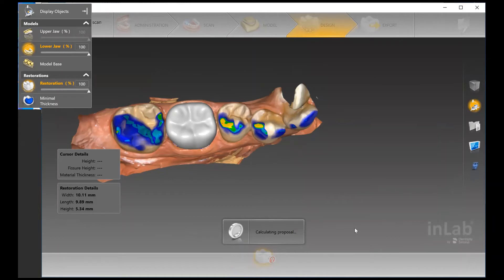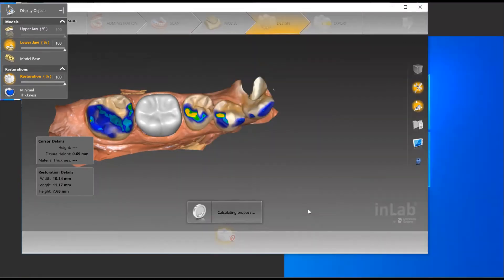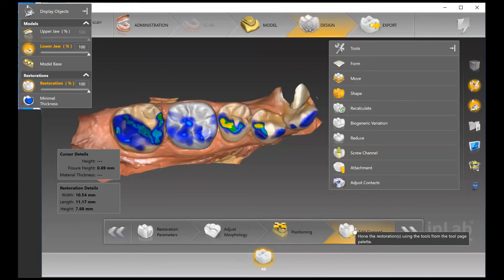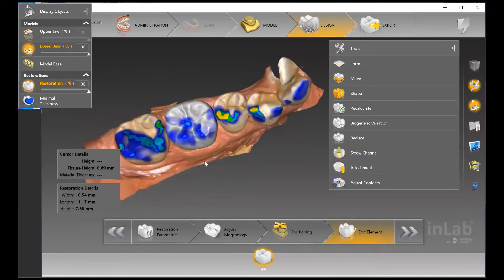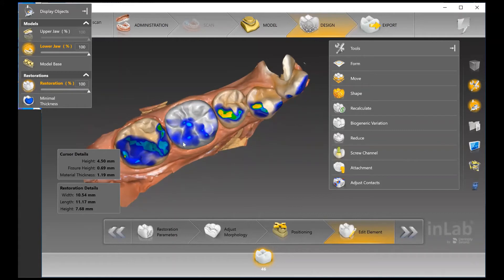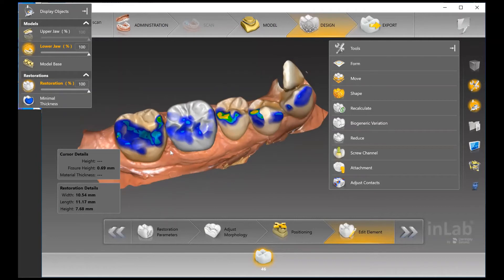In the Edit Element stage, the software is going to generate a proposal — and it does a really great job of this right away. A couple of key things to look at: I always like to check the morphology of the tooth first. Is there anything you want to change on the morphology? If so, I recommend doing biogeneric variation as step one. You also want to check your contacts, contour, and occlusion.